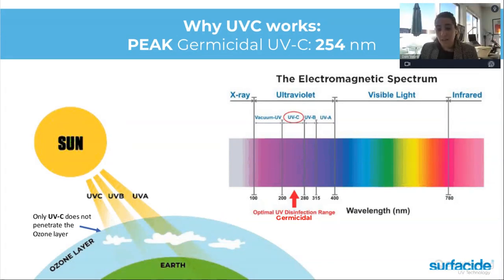The peak germicidal wavelength is 254 nanometers, which is what the majority of the data says, but anything in here is going to have some sort of germicidal effect. The peak germicidal is actually at 254.